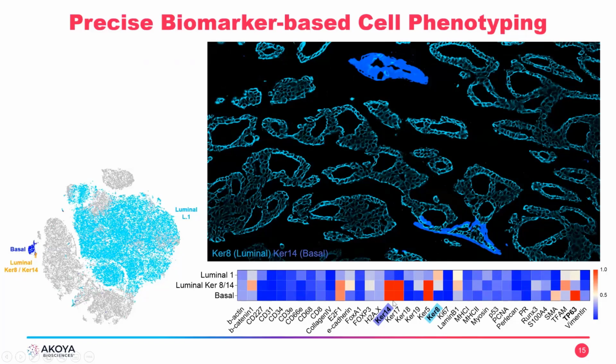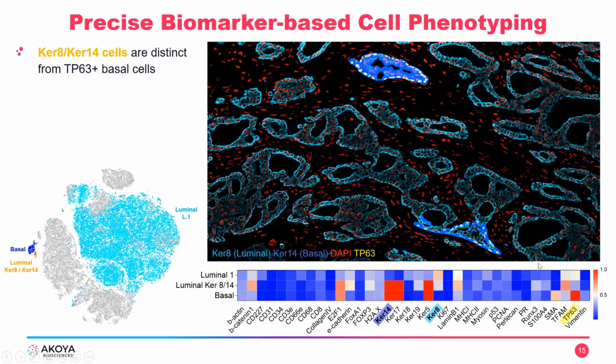So let's take a look, for example, at TP63, down here on the bottom right side. TP63 is a key marker for basal cells. So if you look down here, this is sort of your canonical basal and then your secretory epithelia. Basal cells have this really nice TP63 labeling. See these nice slender nuclei. Now let's go up here where our supposed keratin 8, 14 cells are. You can see that the TP63 very, very selectively labels only the outer layer, the basal cells. There's still a group of cells on the inside that is not labeled. There's these guys in orange.